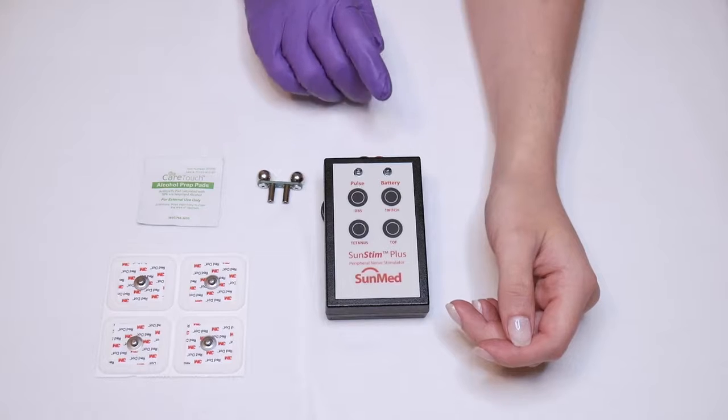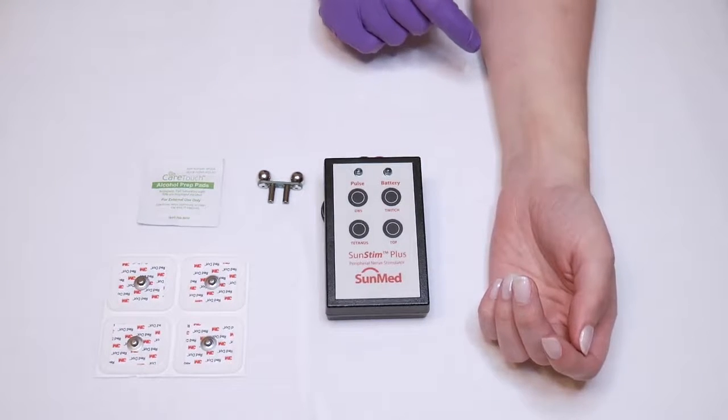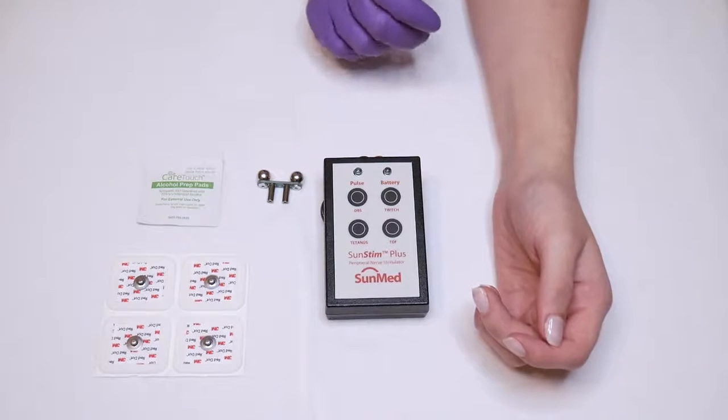In this demonstration, we will be using the ulnar nerve and the train of four function. Refer back to the instructions for use for all acceptable monitoring sites.